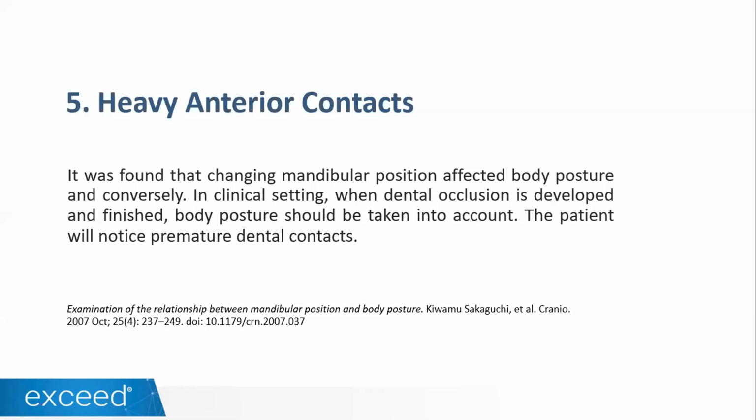And this has happened because, well, mainly gravity. And this is something that has been reported in the literature by not just dentists, physiotherapists. So when we take the bite registration of a patient lying down, normally what happens is that we are scanning that bite with the mandible a little bit towards the back. So when the patient just stands up, that mandible moves a little bit forward.